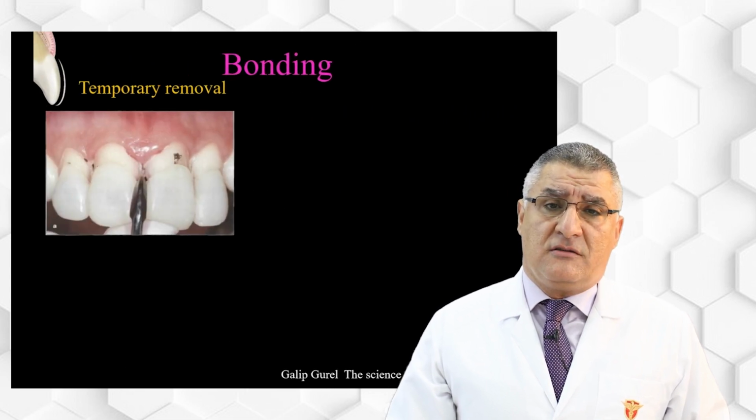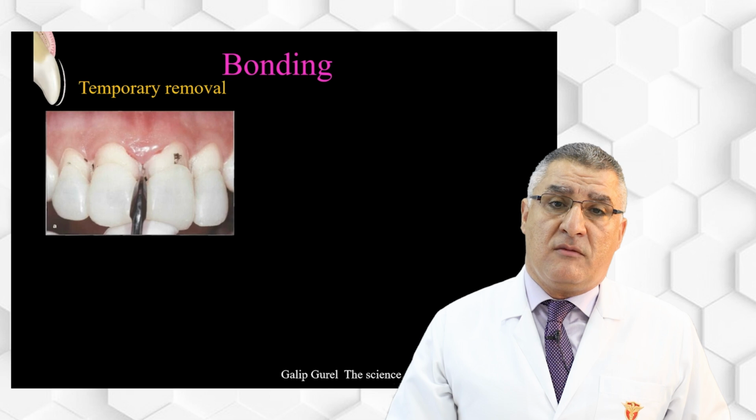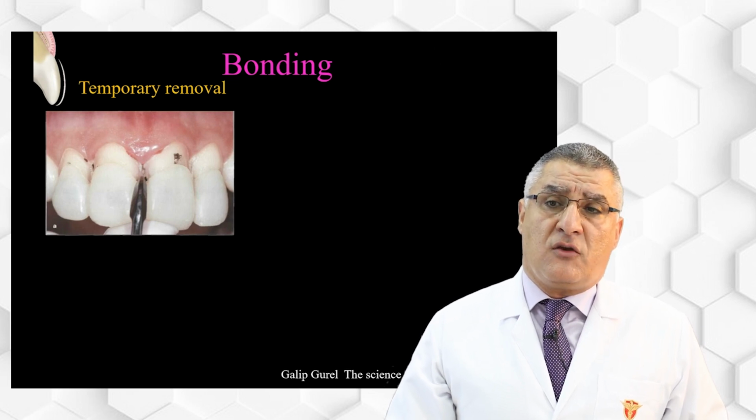Before you start bonding, we have to remove the temporary veneers if you are using a spot etching. By using any heavy duty scaler or universal scaler, you can apply it in the interproximal area and make a slight rotation. This will lead to debonding or removing of the temporary veneers from the tooth. If it cannot be removed, you can cut it with a burr.